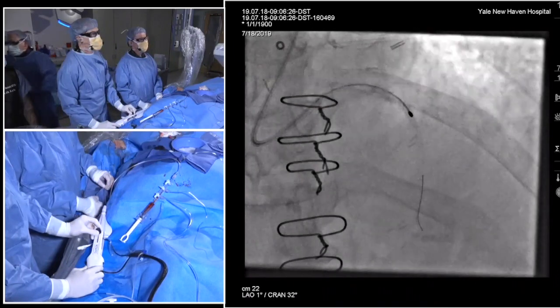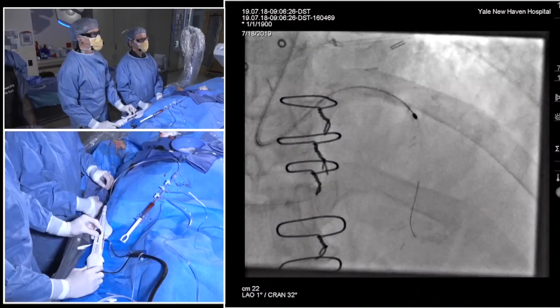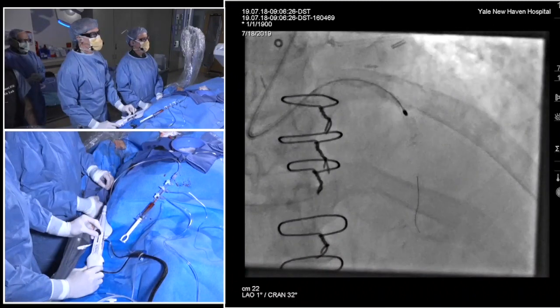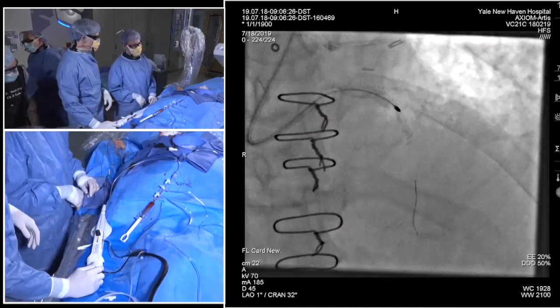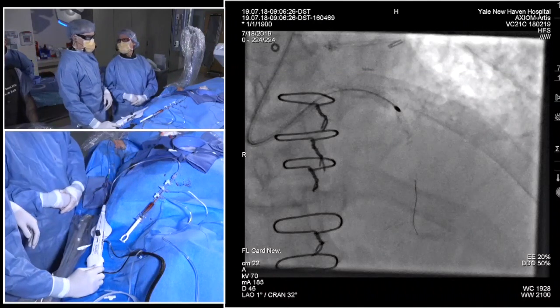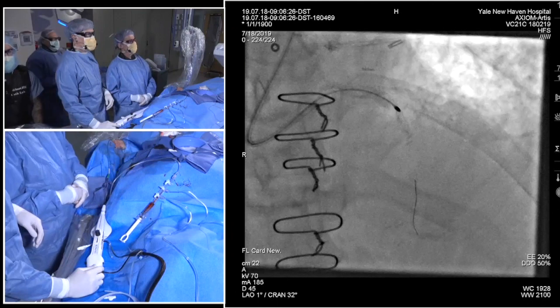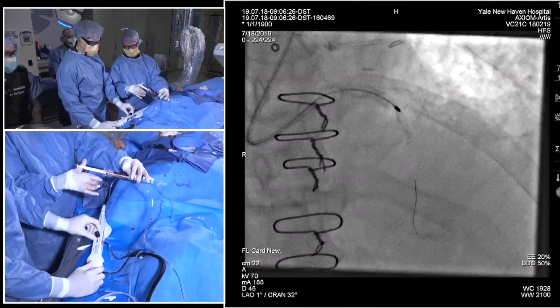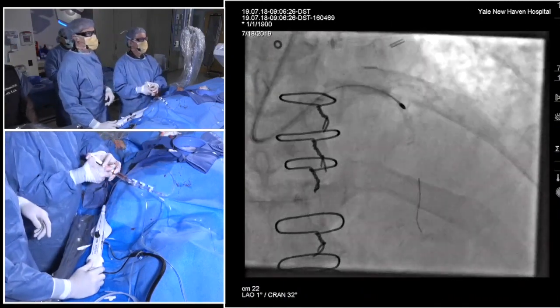So the nice thing about the Roto Pro is that it gives you a lot of warnings if you're not used to using it. People who use the old device had to depend on people reading out the RPM. This shows it to you visibly, and it's easy to see, and the acoustic feedback is the same. So for somebody like myself who's been using it for probably 25 or 30 years, it's pretty much the same, but a lot easier to use.